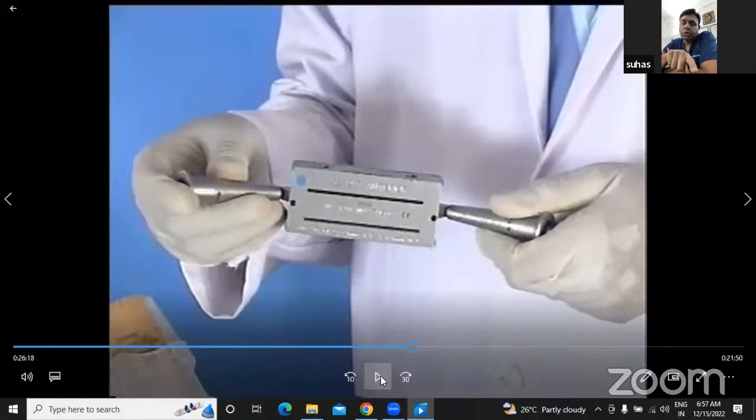The way for you to know whether this is the correct rotation or not is the bony landmarks that we discussed last time, which are the Whiteside's line and the transepicondylar axis. In PFC anyway, you don't have the clinical ability to check. So based on these two, you'll have to decide whether you want to externally rotate more or not, which again is a manual step, which is not recommended if you are just beginning. So in your PFC, you have a fixed external rotation of 3 degrees.